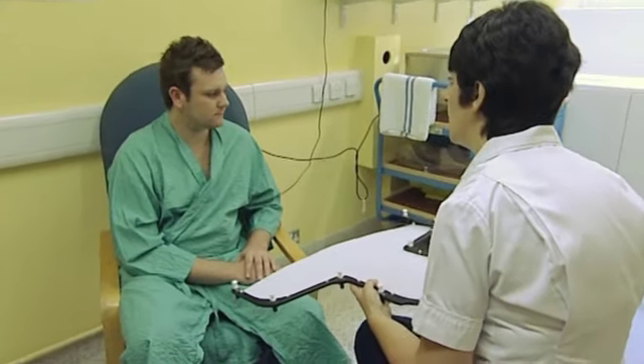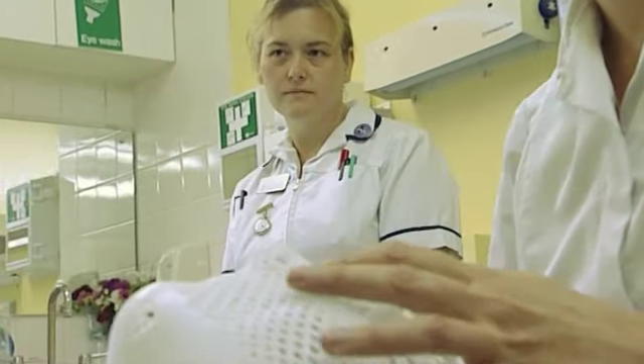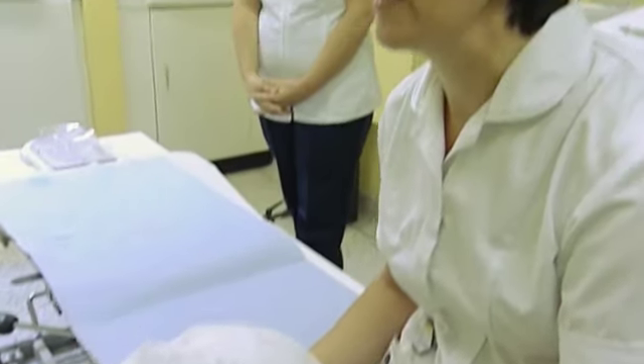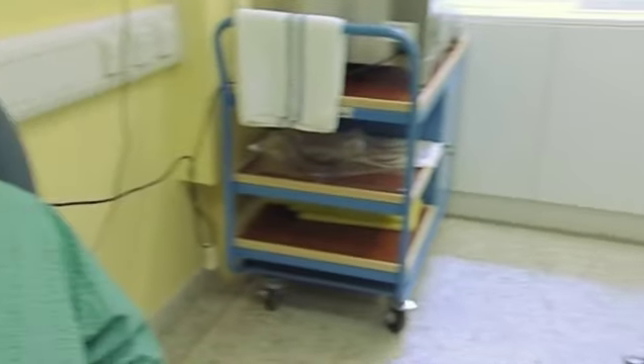I'll come in from behind, rest this over your shoulder area. I'll bring the patient into the mould room, introduce myself and my assistant, and then explain to the patient the procedure they're going to go through today and cover any concerns or worries they may have. So we're going to give you some radiotherapy to your larynx area. You've already been through to our simulator and we've decided on a position for your treatment which we want to replicate here in the room. Hazel's going to assist me to do that.